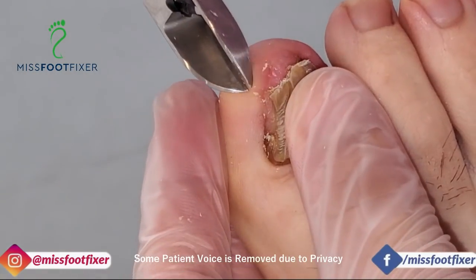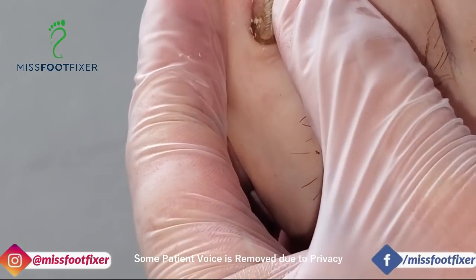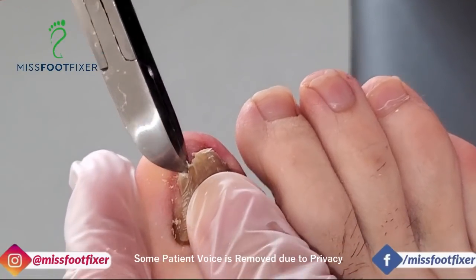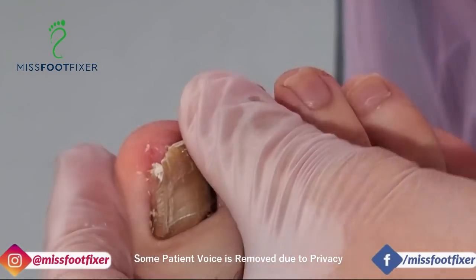Well, that was a big chunk we took out actually before. That was the main bit, the bit that was cutting into that skin. Let me just check how far down I can still go.